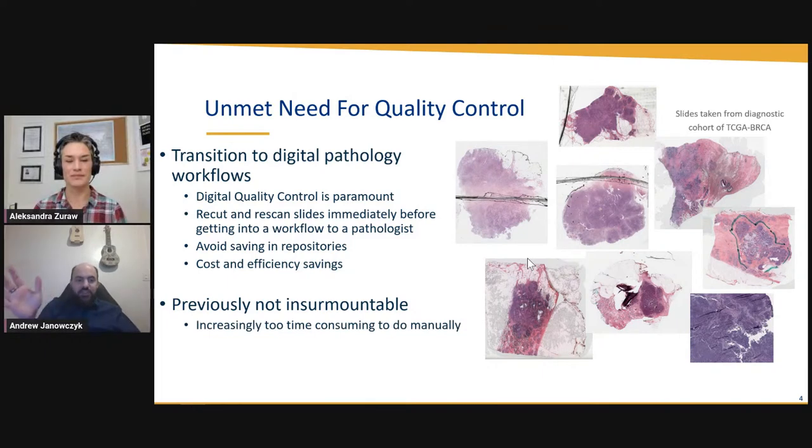But now it's clear that this is really just too time consuming to do manually. There are hospitals that are generating 4,000 slides a day. And you really can't think about spending 5 minutes per slide just to analyze it for quality control. You've now defeated the entire purpose of that kind of high throughput process of generating digital images. And then most importantly, from a scientific standpoint, and we touched on this earlier, if I have to make a decision unaided about what is good or bad quality, it essentially makes it non-reproducible. Now there's a human bias factor, right? I can look at something and say, maybe this is good today. And maybe the next day I'll be a little bit more pessimistic and say, it didn't really work yesterday. Now I have some type of fluctuation. As a scientist, we want to try and hold as many variables constant as possible. So if we have deterministic measurements, we can leverage those measurements to really reduce the variance in how we perceive quality over time.